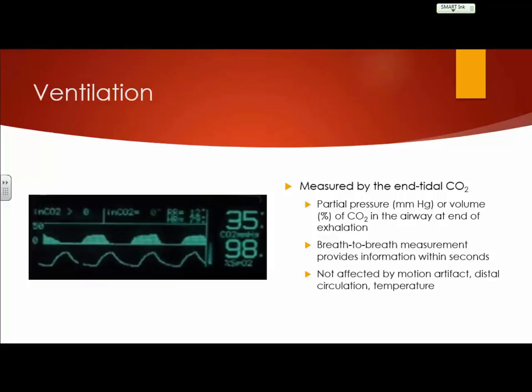Sometimes patients may have aspirated and you get junk up, or let's say you've intubated somebody with pulmonary edema and you're getting that junk up from the lungs, or somebody with pneumonia and you're getting that sputum up. What may happen is that junk clogs up your lines very easily.